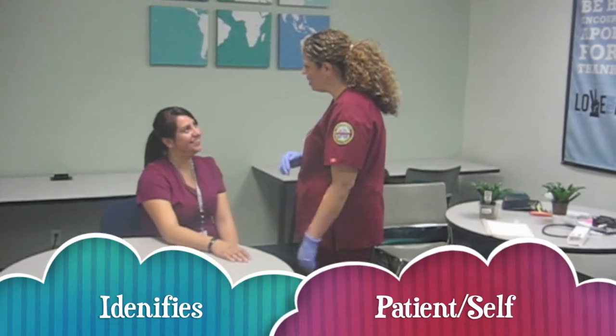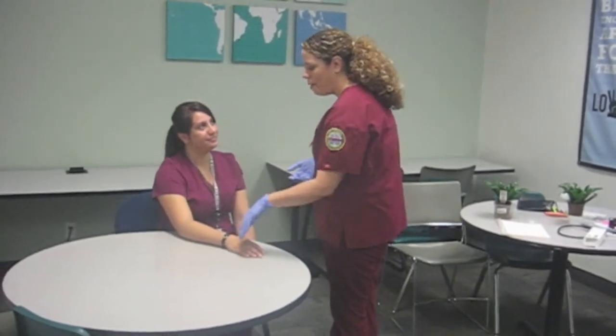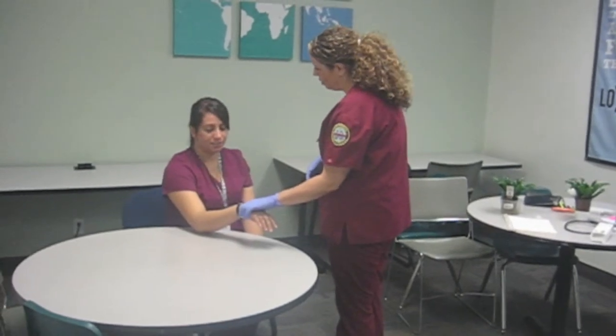Hi, I'm Athena from Respiratory. How are you? Good. The doctor has ordered an inhaler for you. But first, can I check your wristband and verify your name and date of birth? Sure.